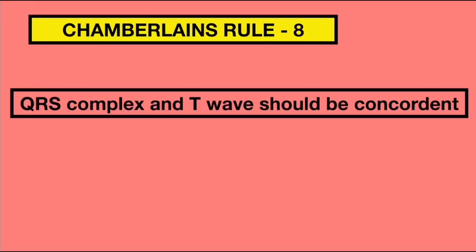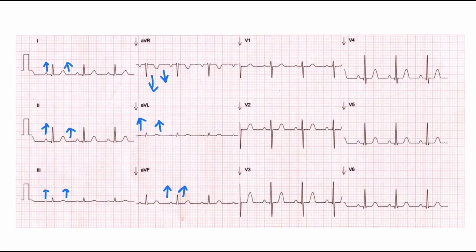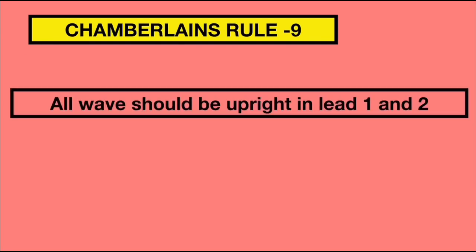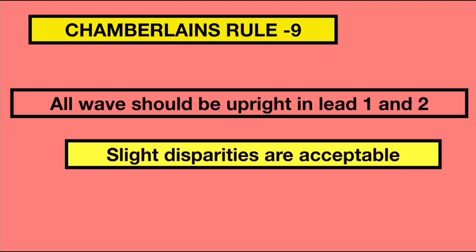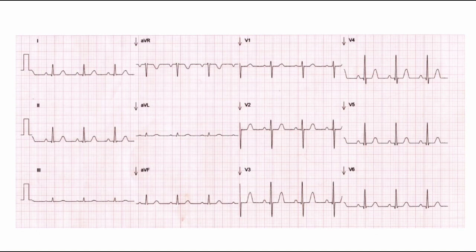Rule 8 states that in limb leads, the QRS complex and T waves should be concordant. Here we can see that the QRS and T are concordant. Rule 9 states that in lead 1 and lead 2, all waves should be upright. In this ECG, we can see that all waves in lead 1 and lead 2 are upright.